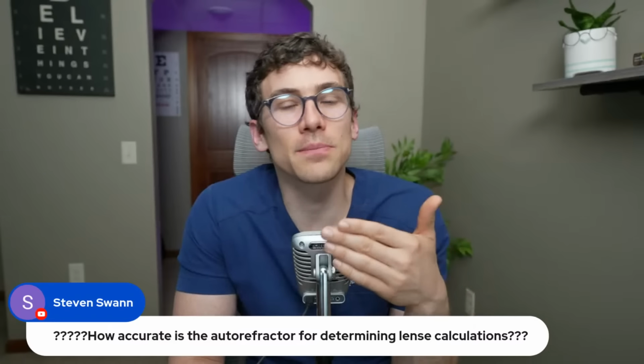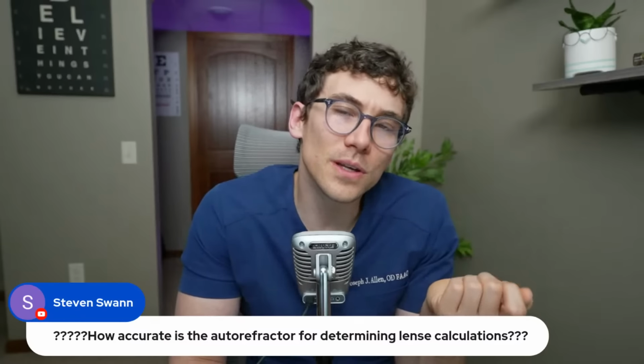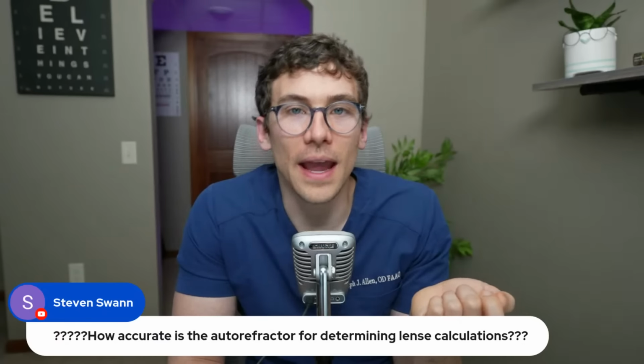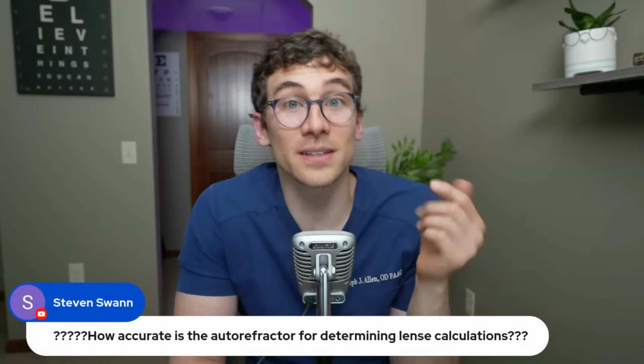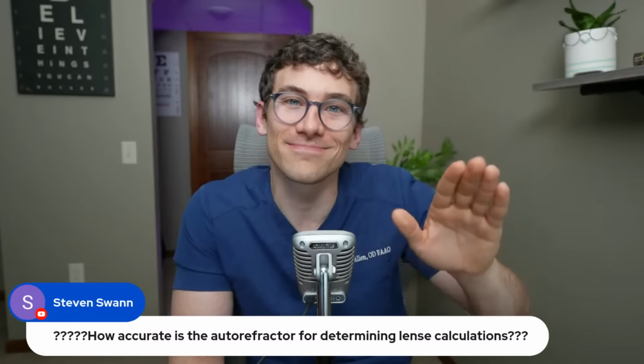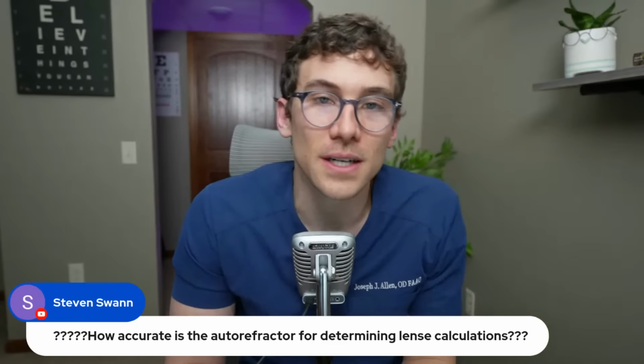It usually takes multiple measurements very quickly and gives us an average. It's also something that I've seen faked and fooled, especially by young children and from advanced cataracts, because the light has to pass through that cataract. And if your cataract is really dense, that autorefractor reading is really tough.